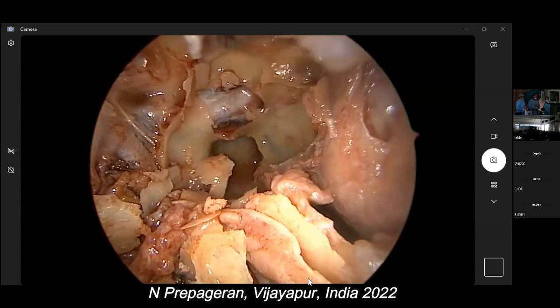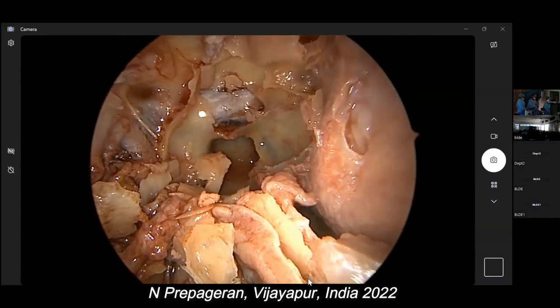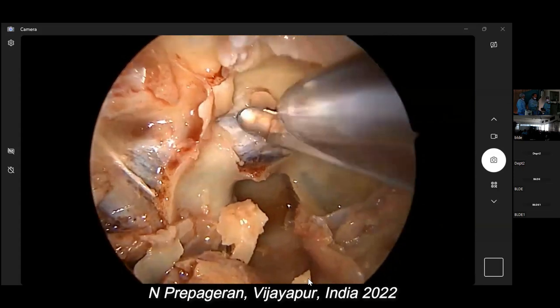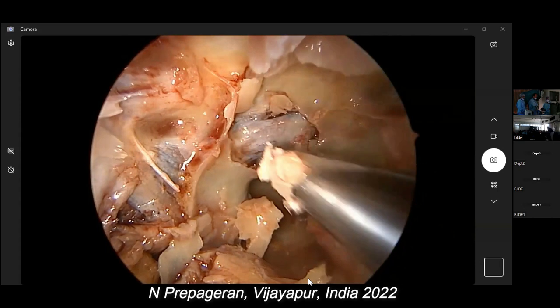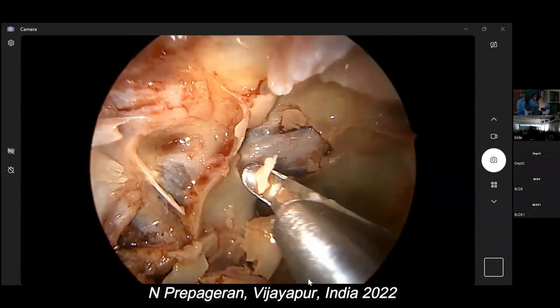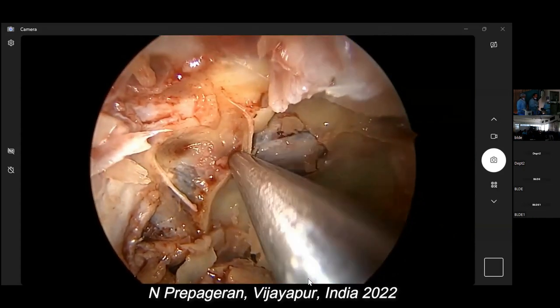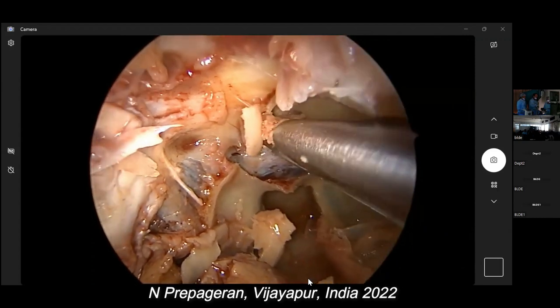Okay, that's it. Now I'm going to remove the bone. Most of the time, the dura will be very thin in a cadaver. It's not tough in a cadaver. So let's see whether we are able. Now I'm coming to the carotid artery region. Can you see? Yes, sir. So I'm going to flick it at the carotid artery region and see whether I can loosen all this bone or not.